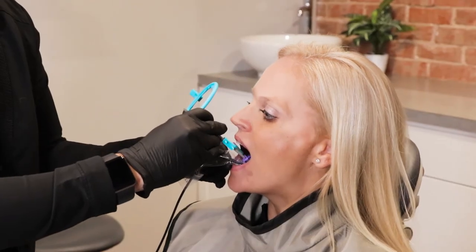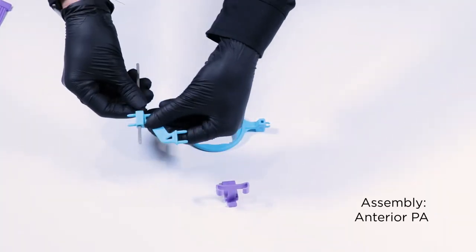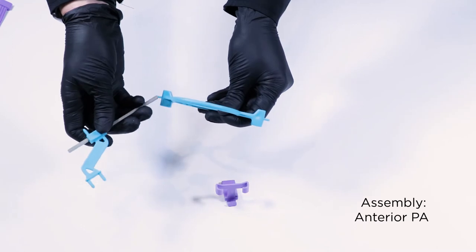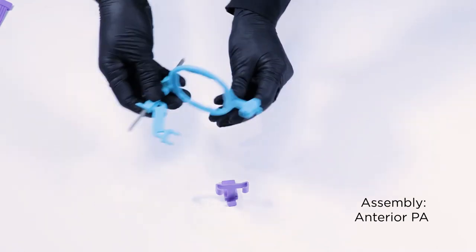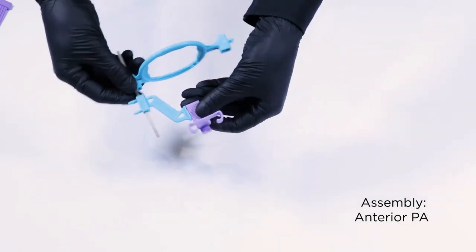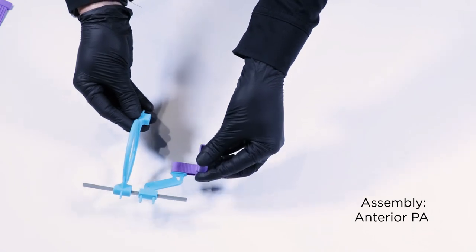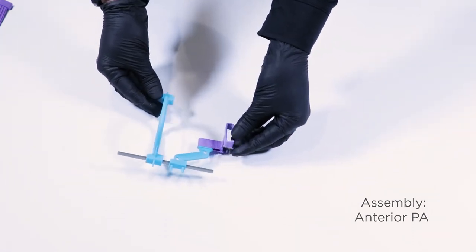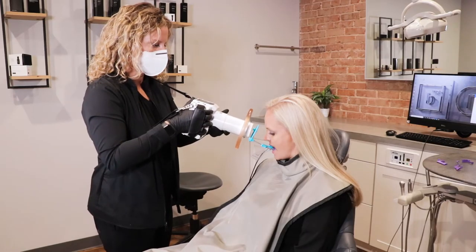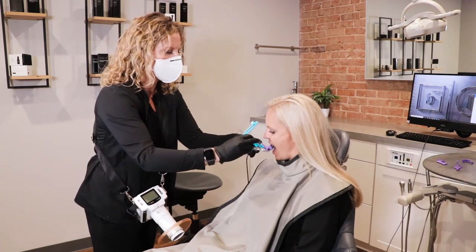For the upper anterior periapical x-ray, scoop the sensor into the palate of the mouth and place it behind the upper anterior teeth. Have the patient bite down. If needed, they may use their hand to hold the bar steady. Push the ring as close to the face as possible. For the upper anteriors, the ring will be very close to the nose. Line up the x-ray tube with the ring and expose the x-ray.